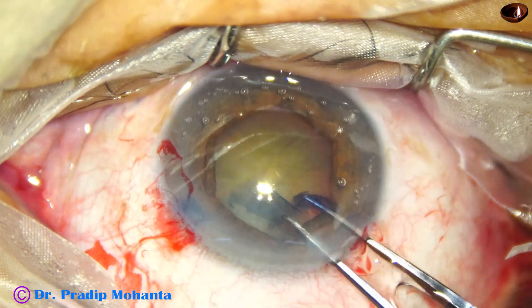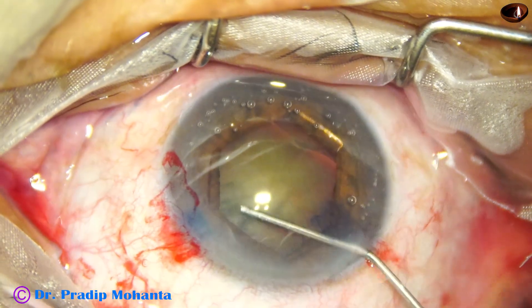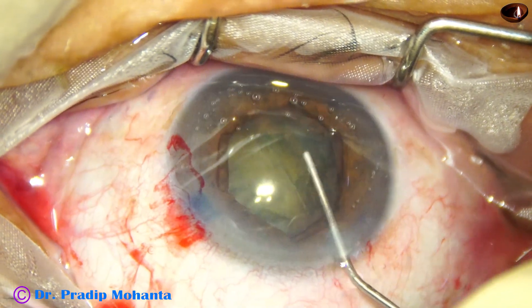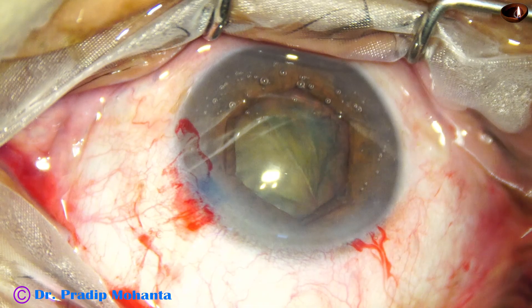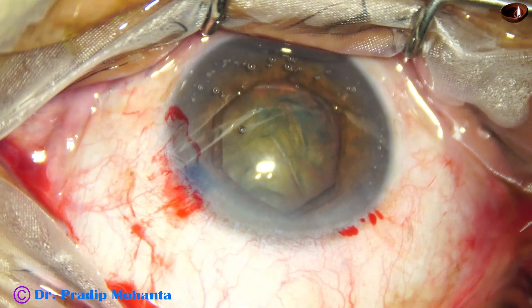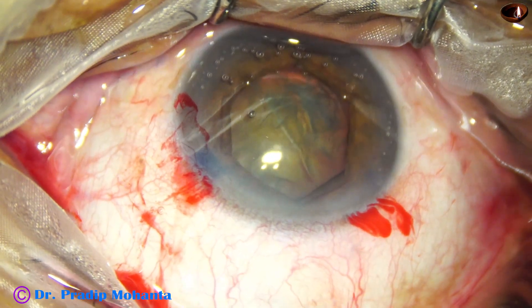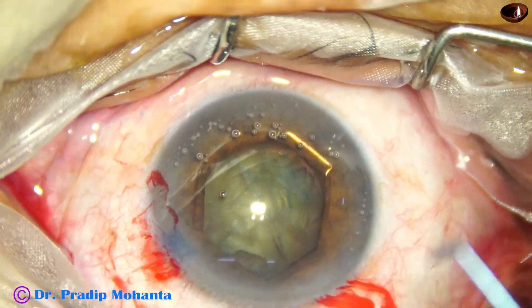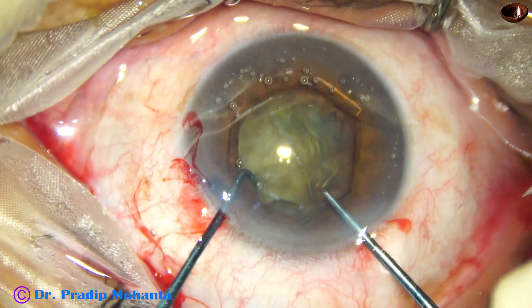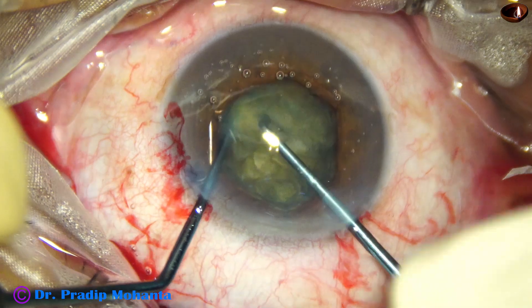You cannot be very slow in moving this tag. A small jerky pulse controls its path better. Now hydrodissection is done. The patient is under topical anesthesia and was initially not much cooperative, but now the patient is cooperating well. Now is the time for pre-chopping the nucleus. If the nucleus is soft — grade 2 or grade 2 plus — I usually pre-chop the nucleus nowadays and management becomes very easy.